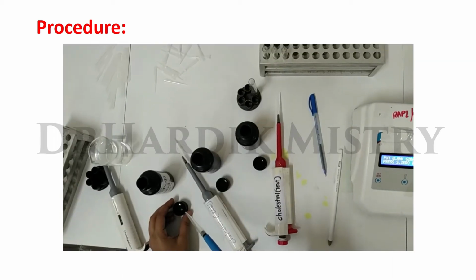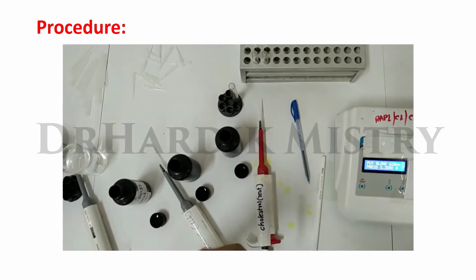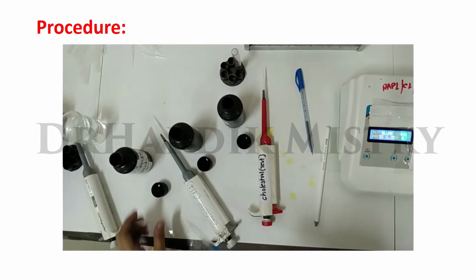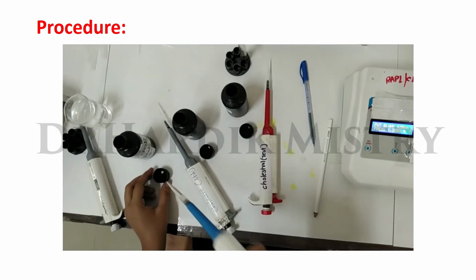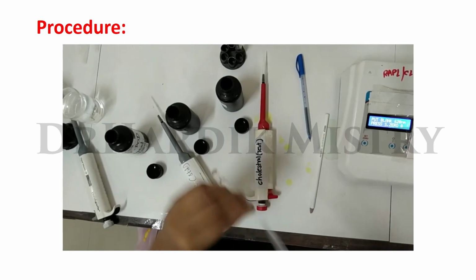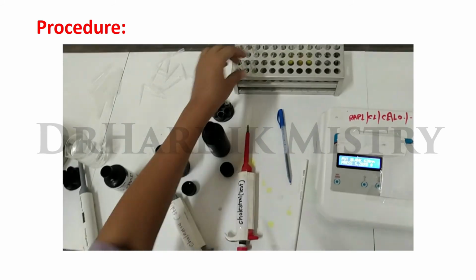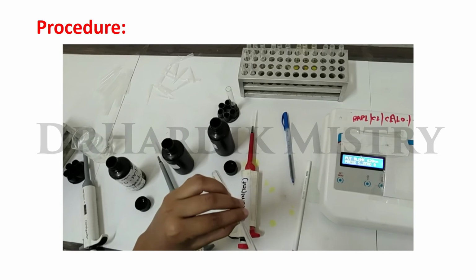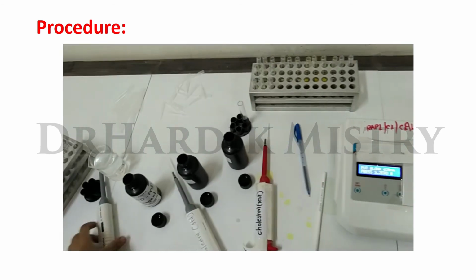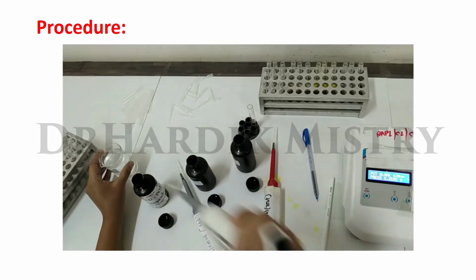Now here is the procedure. Take 3 test tubes and label B for blank, S for standard, T for test. Add 1 ml of cholesterol reagent in all 3 test tubes, blank, standard and test. Add 10 microliter of distilled water in the blank test tube.